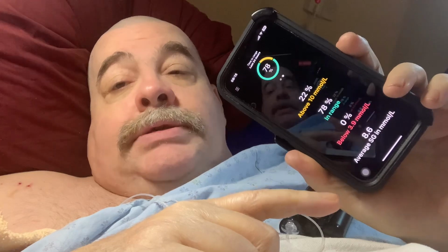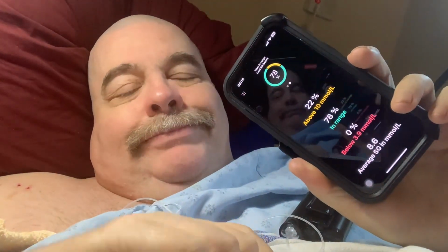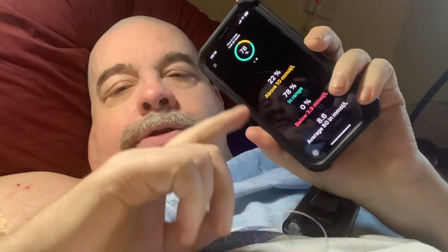Before, we didn't know this. The only thing we ever had, look, you can see me again and again and again. Don't miss out on understanding time in range. The old system of hemoglobin A1C is for people still on multiple injections. This just takes a next step up. You really want to utilize your pump for everything that is available to you, that applies to you.